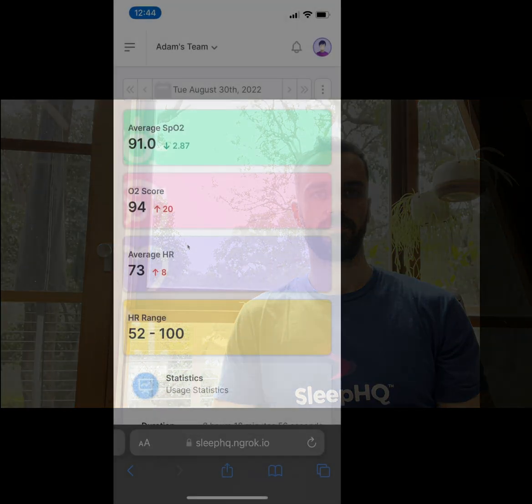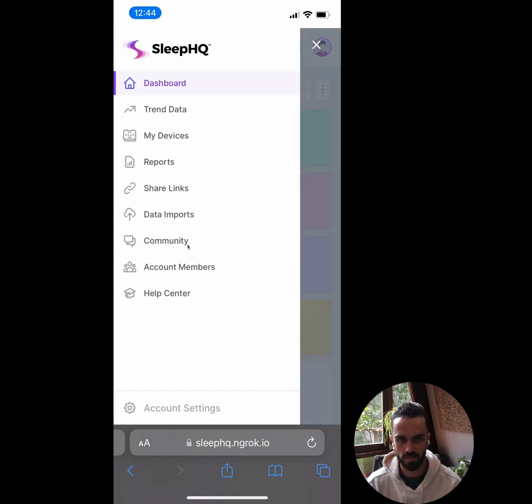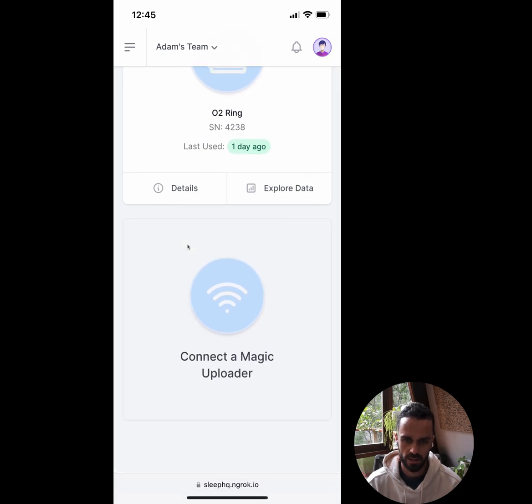I'm on my phone now and I've logged into my SleepHQ dashboard — just gone into the web browser on my phone and logged into SleepHQ like I normally would. I'm on the dashboard right now and I want to go across to the 'My Devices' menu. I'll open up the menu, click 'My Devices,' and you can see under My Devices I've currently just got an O2 Ring. If I scroll down, there's a 'Connect Magic Uploader' button — that big square one — I'm going to click that.